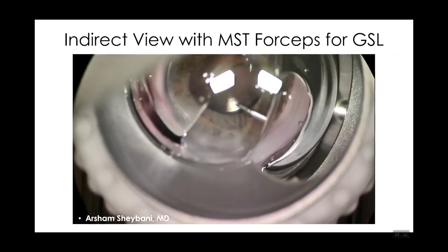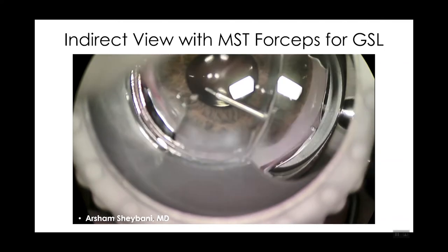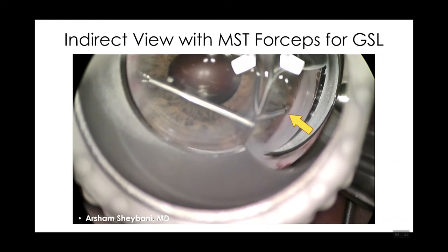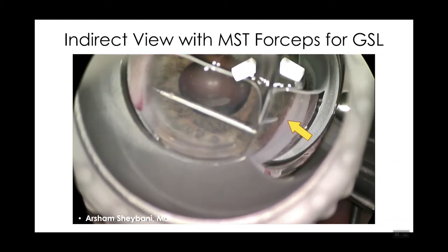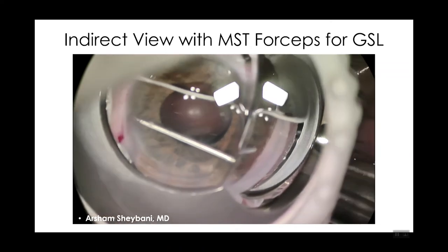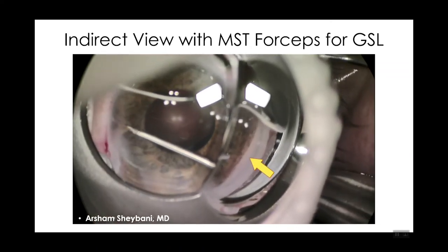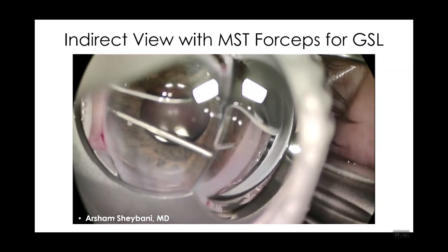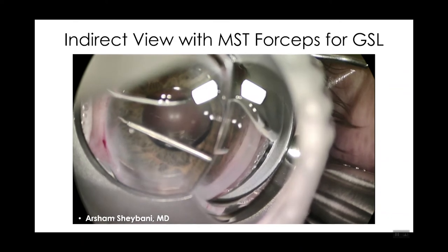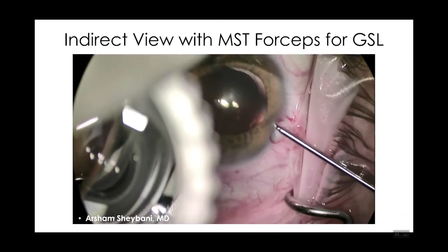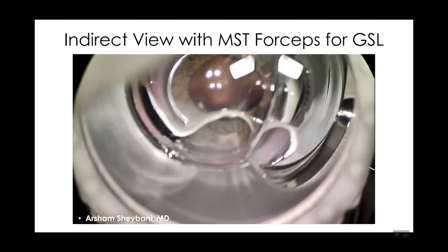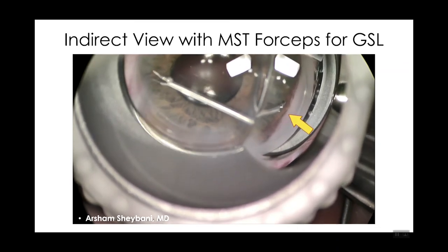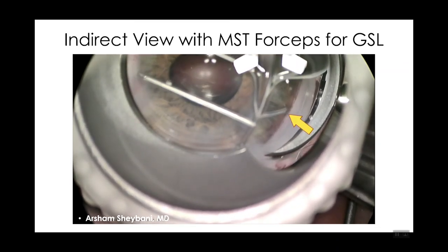You can also perform the procedure with an indirect view. All of the prior videos were direct views. Here, Arsham Shabani from WashU is performing an indirect view with MST forceps taking down the PAS. You can see where the arrow indicates exactly where the PAS was and how it's pulled down. This is a more difficult technique, but it has the advantage that you don't have to reposition the patient or the microscope — you can keep the microscope upright as you would for cataract surgery.